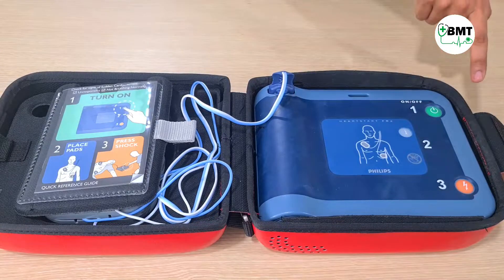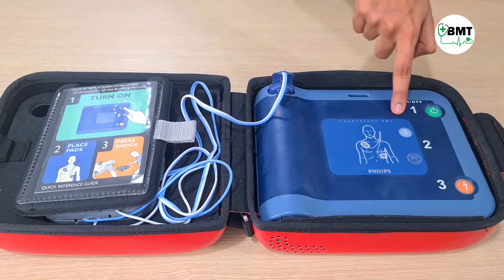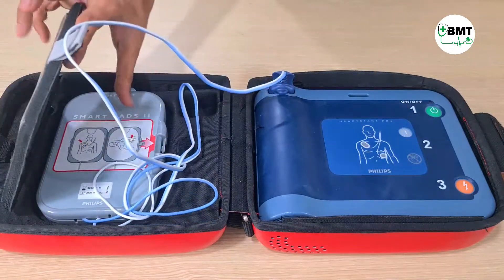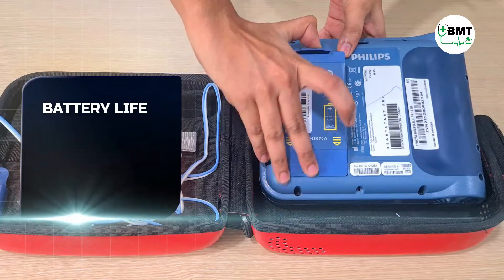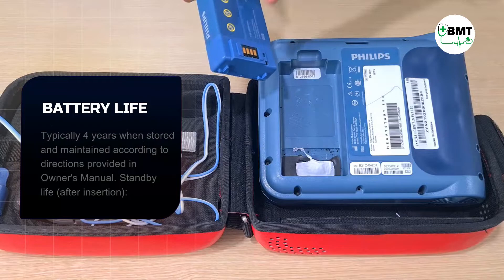In the machine it includes an on-off switch, shock key, and the info key. This is the connector which gets connected to the disposable pads. This is the battery. Press and remove — this is kept here to avoid contact.